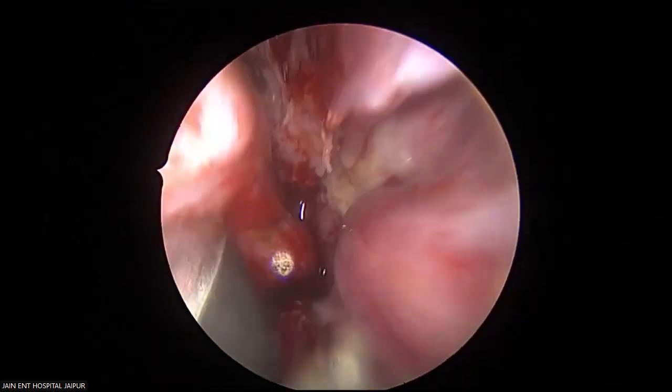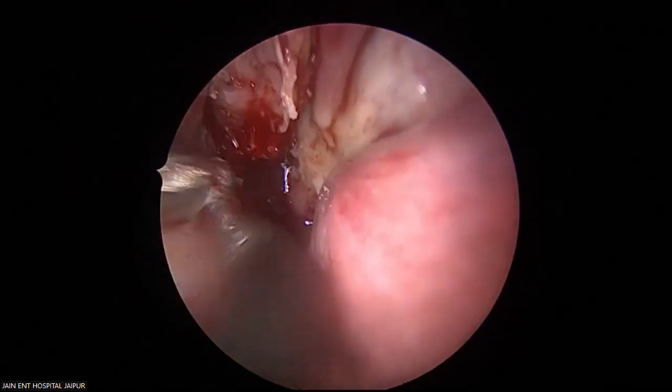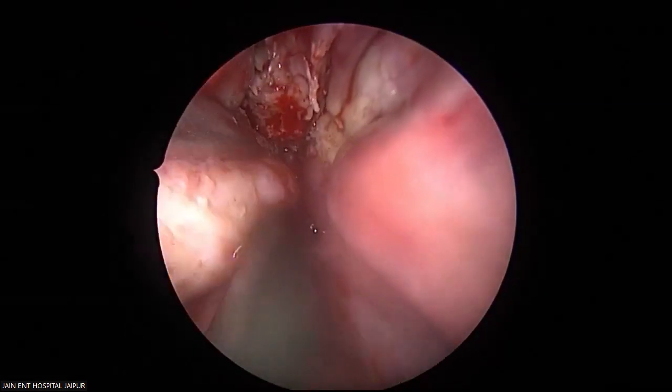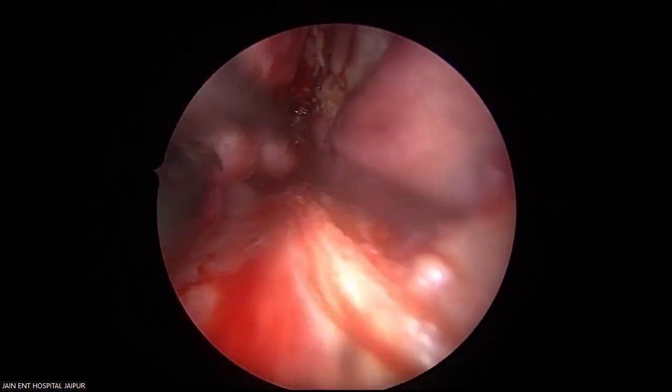See this tumor, which is the medial surface coming in exposure, being coagulated now. Yes. We have gone far medial and behind the tumor, the entire surface is coagulated.